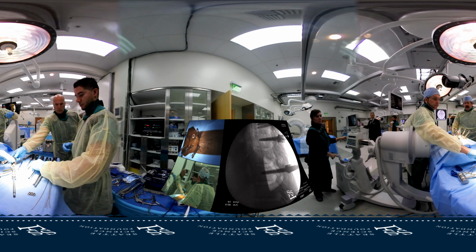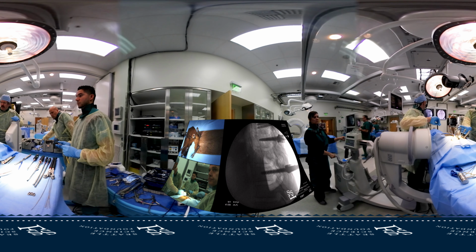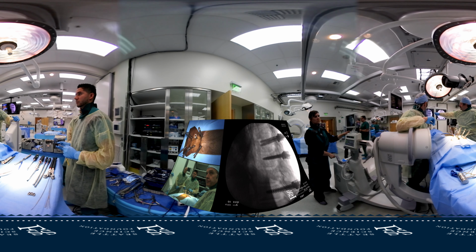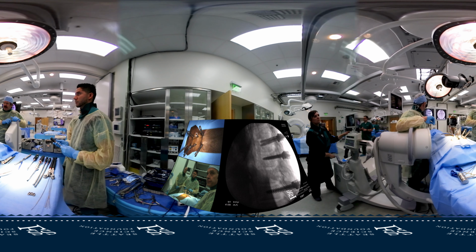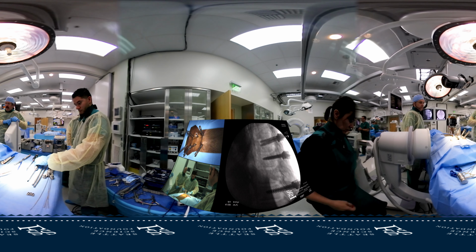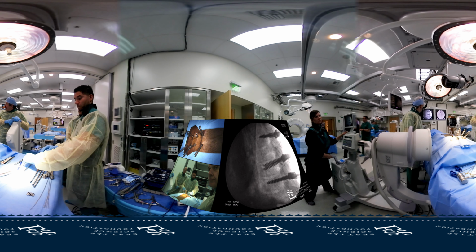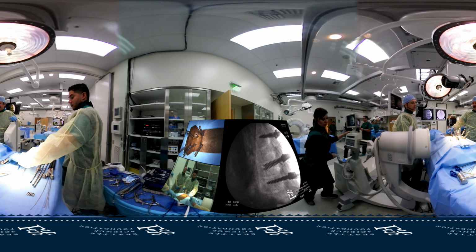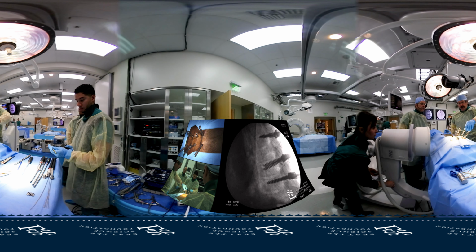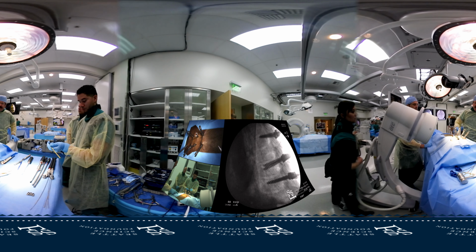And so now if we go north, you can see we've got screw, we skip the body, picture. We've got two screws. We're going to assume the fracture is between those two and go north. Picture. And we have one more set of screws. Go to the AP, because I'm going to show you. I have one screw that's a little bit medial. It's that one. This one? Yeah. So roll it to the AP.